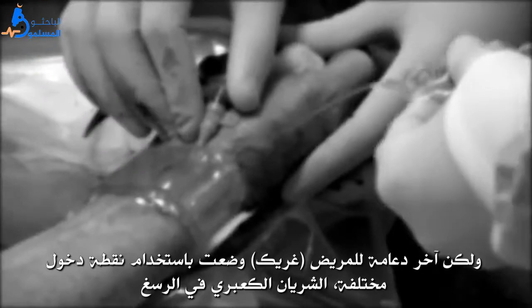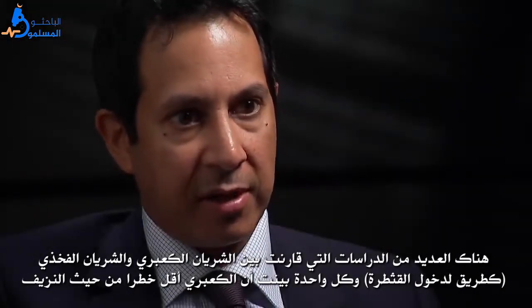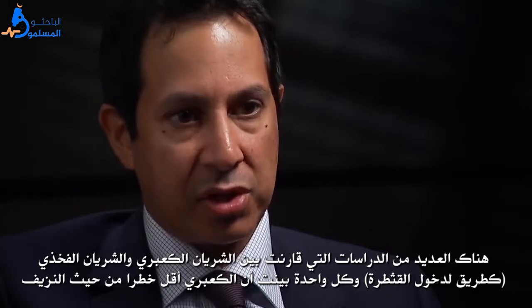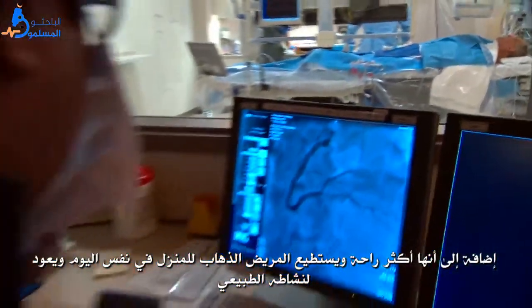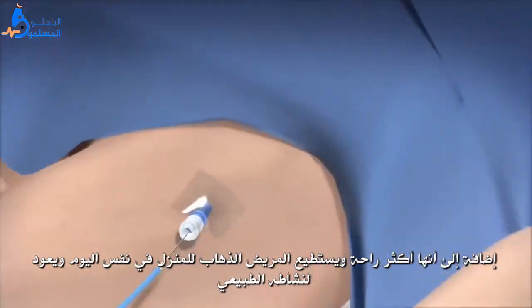But Greg's last stent was placed using a different entry point — the radial artery in the wrist. There have been a number of studies now that have compared femoral versus radial access, and every single study shows a lower bleeding risk. Plus, there's often less discomfort, and patients can go home the same day and get back to normal activities.